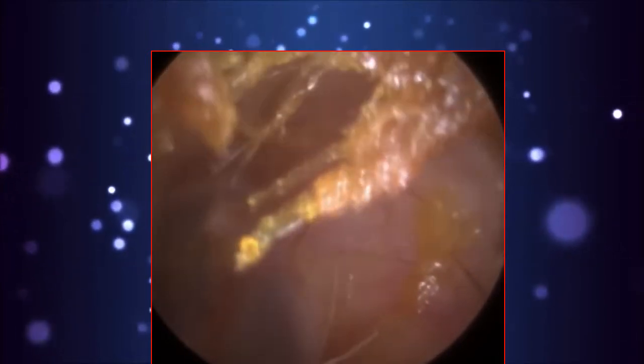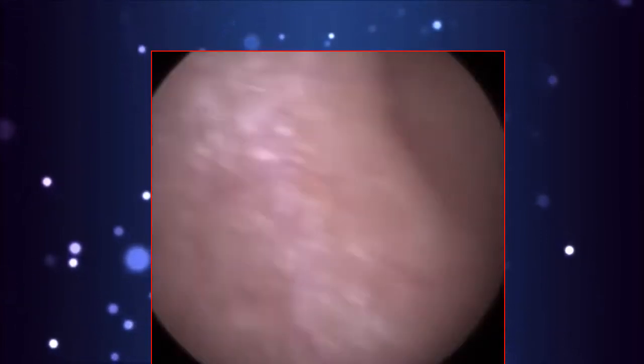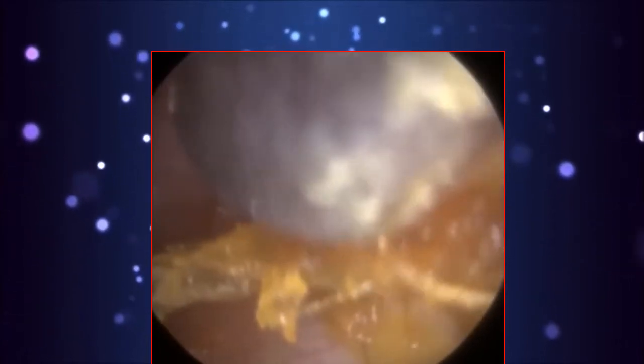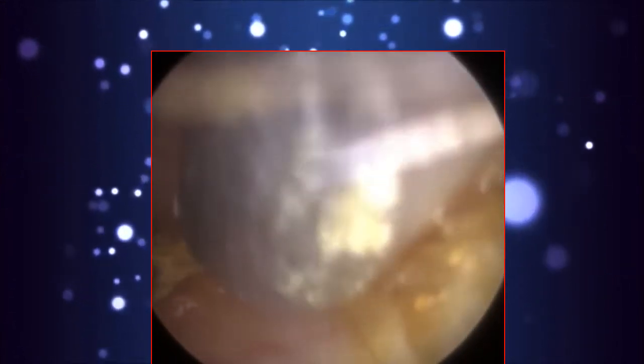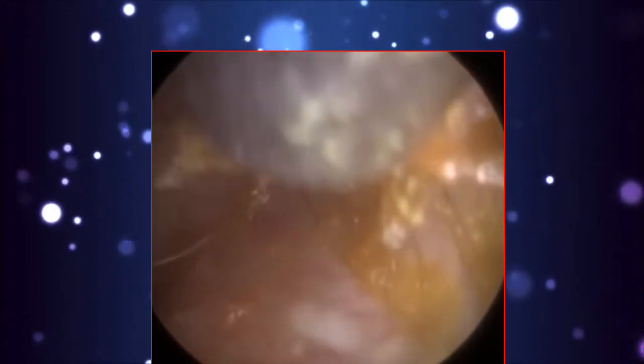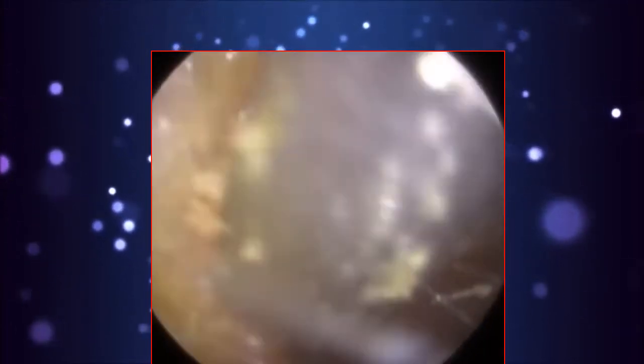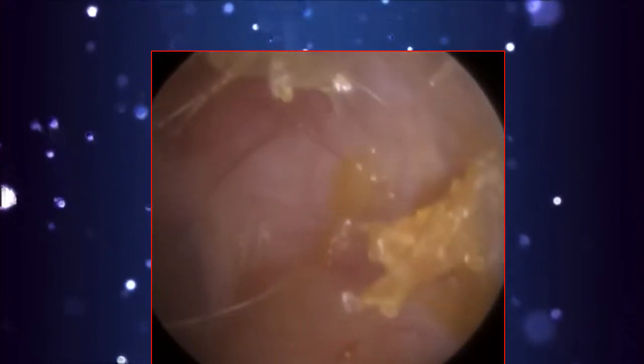Now there's a few loose hairs a bit deeper in the ear, and if you keep watching you will see that I do remove some of those. Now in hindsight, I'm going to be a bit tough on myself. I probably should have left them, because I used some forceps to remove it, and because it's on the bony part, and I keep stressing this point on all of my videos and to my delegates. When I use the forceps, the bottom jaw, and actually the distal end, the tip of the forceps, is quite sharp. And as I was trying to get the bottom jaw underneath the loose hair, I made the mildest contact with the bony part of the ear canal. You'll see in a moment, I'll highlight it to you when it happens, which very slightly grazed the ear canal.